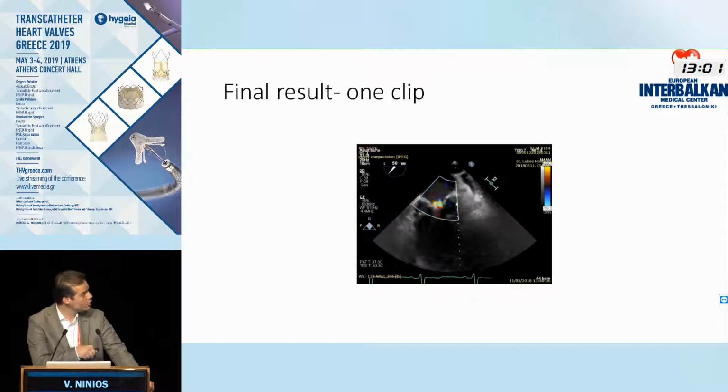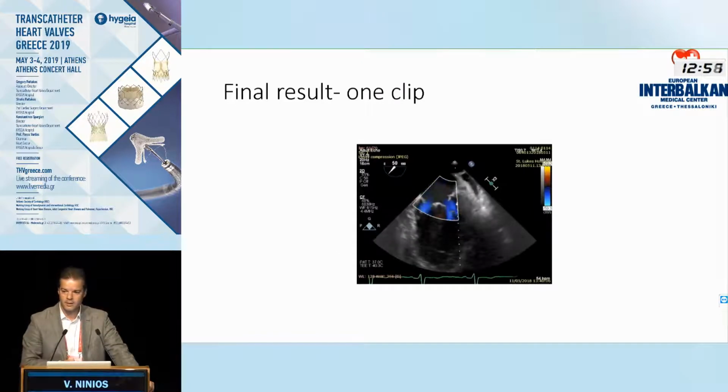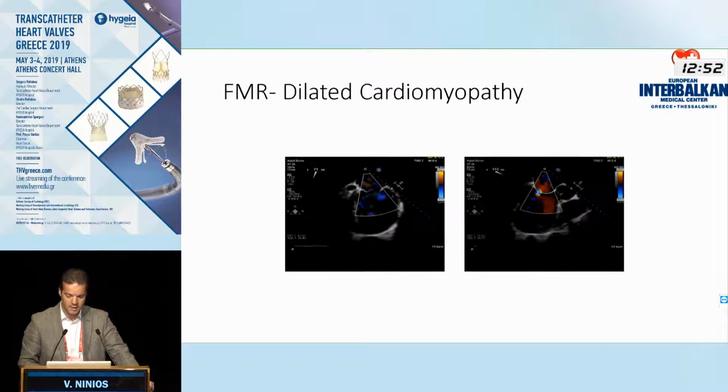And actually this job is done. There's another narrow jet on the lateral part. Here we decided to leave this. And it was a successful case with one clip.